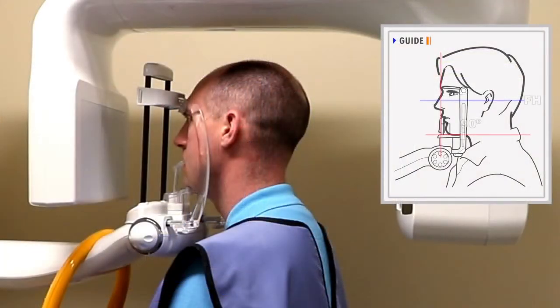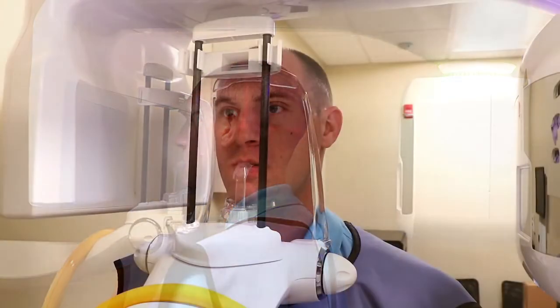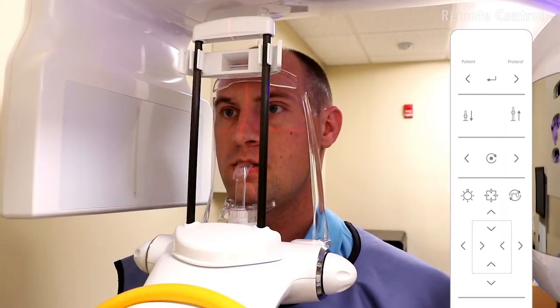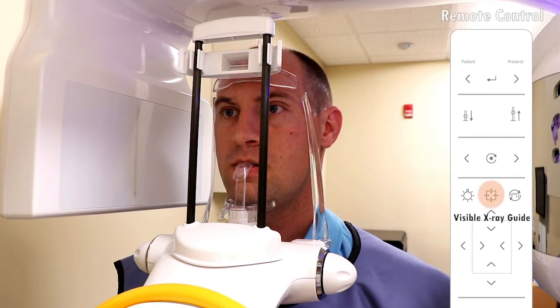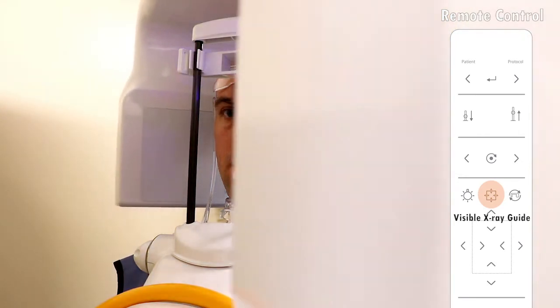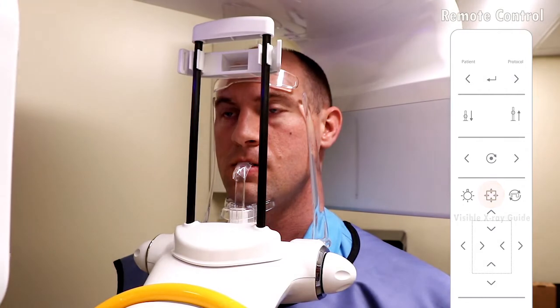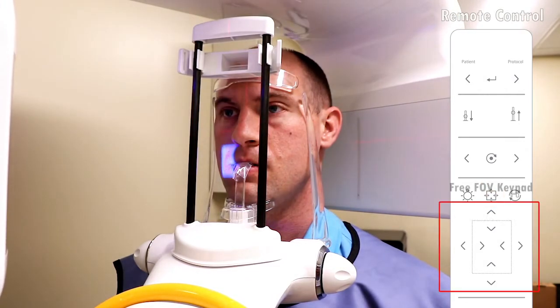Improper patient positioning can result in anatomy not being captured in the image. Turn on the visible x-ray guide by using the remote control or the touch screen. The Ray scan will rotate and the blue light will illuminate the area selected in the scanner program.